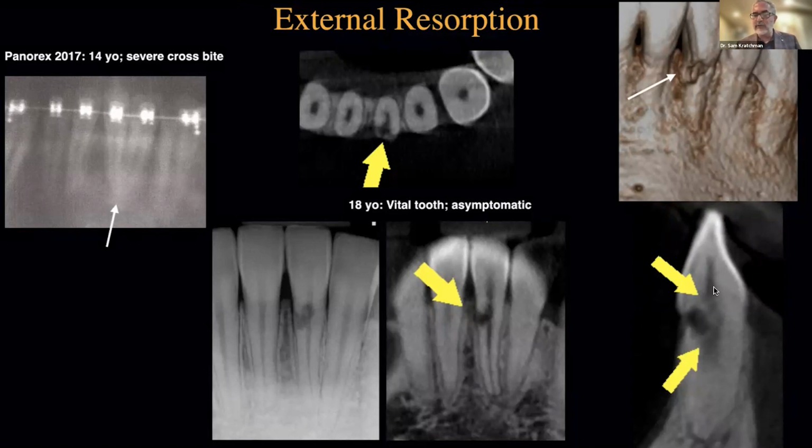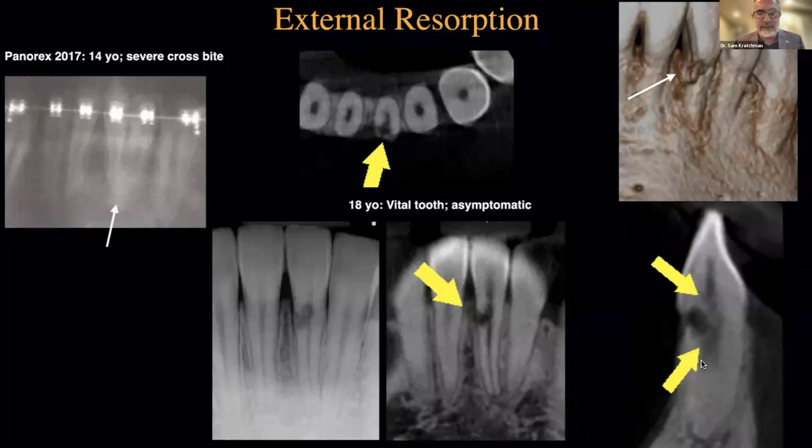Because if you just do a root canal, considering the fact that this is external, the resorption is not going to heal because it's not coming from the pulp. This is derived from damage to the PDL. Therefore, you need to have access to it, to clean it, and to restore it. And if you're going to operate here, you need to make sure you're cleaning everything out. So, of course, you're going to have to do the endo in something like that.